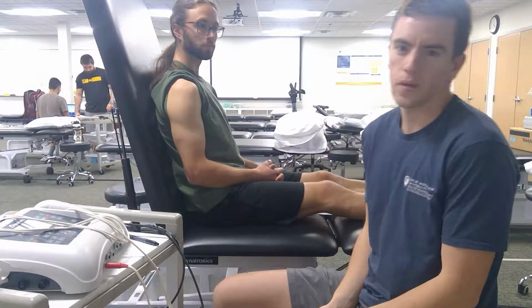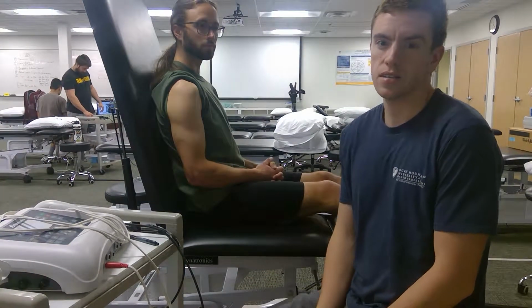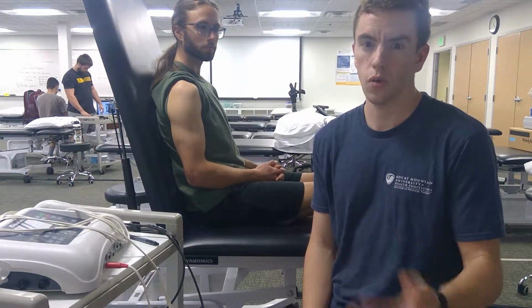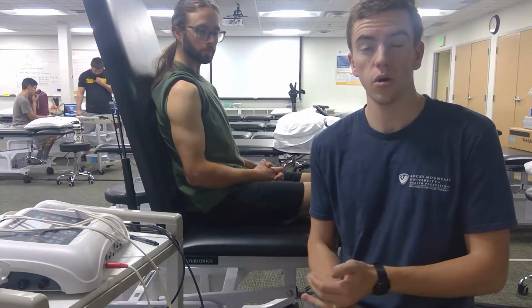All right, so today we're meeting with Greg, who just had some problem with his right shoulder, osteoarthritis. I'm going to be demonstrating how to apply biphasic pulsed current, specifically the normal or high frequency TENS application that we're going to be doing. Some of the indications that fit this patient are osteoarthritis in that right shoulder joint, and he has a considerable amount of pain.